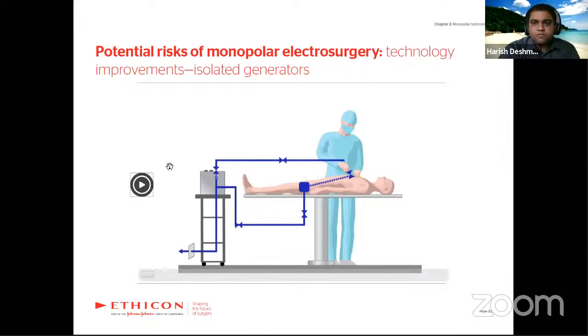This is a question from sir. Basically, when we are using a Liga clip or Hem-o-lok in a case and we are using electricity, generally these titanium alloys or titanium are inert materials. So there is no current which will cause any kind of effect with this tissue. But in the case of Hem-o-loks, it may affect because Hem-o-loks are plastic in nature and they react to the heat.